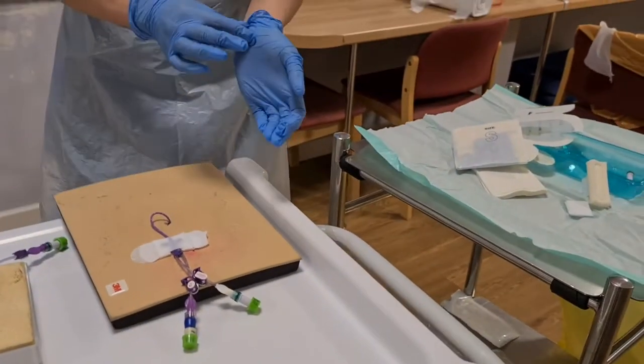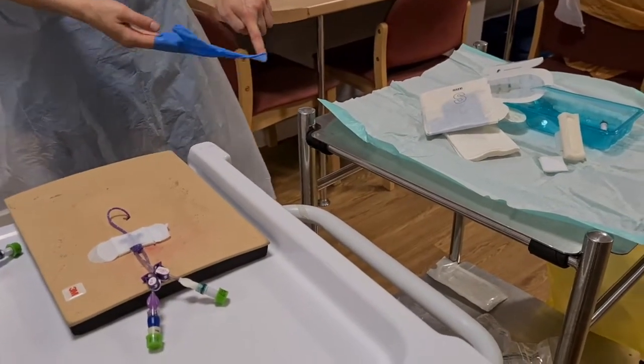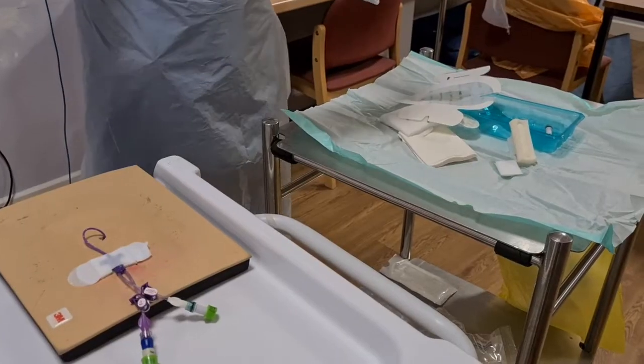At this point, I'm now going to remove my non-sterile gloves, place them into my bin, decontaminate my hands, and put on my sterile gloves.